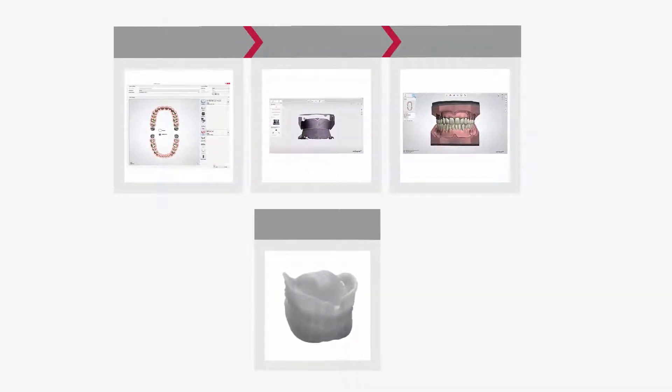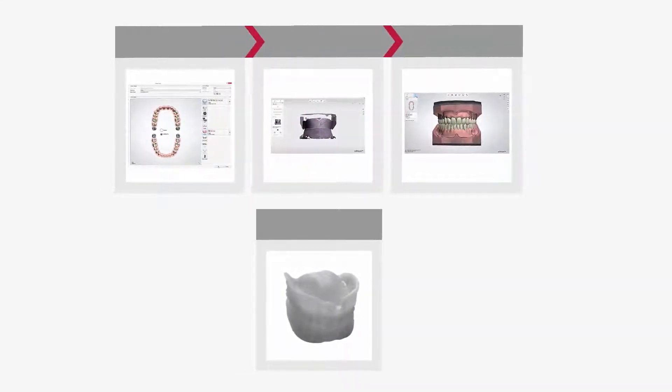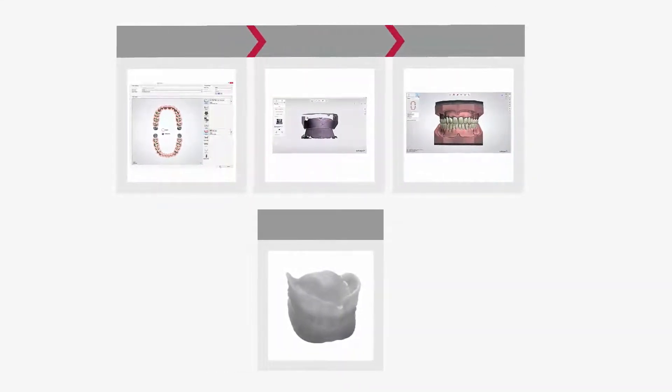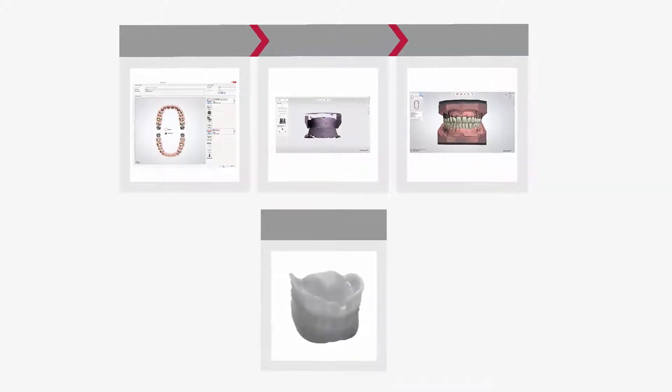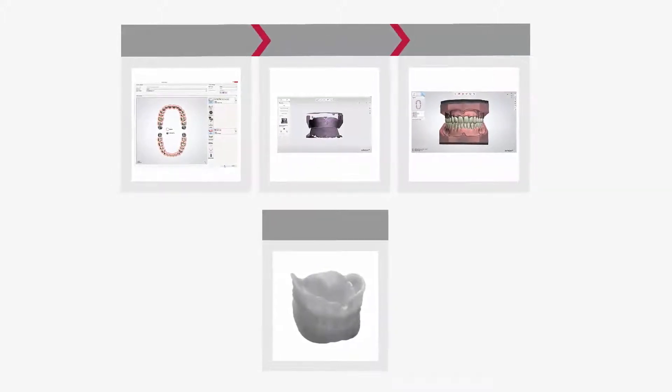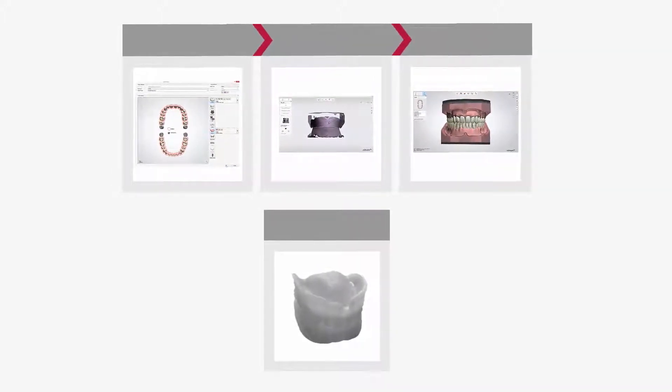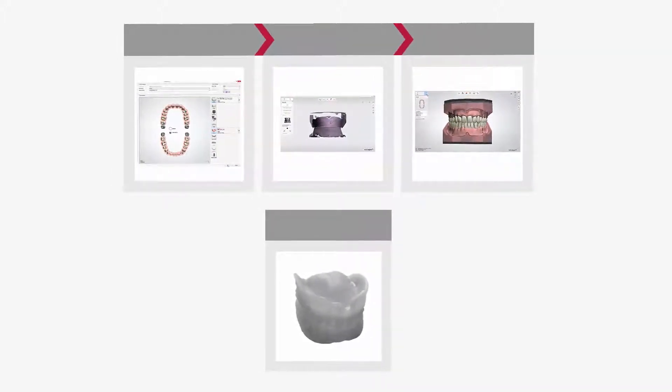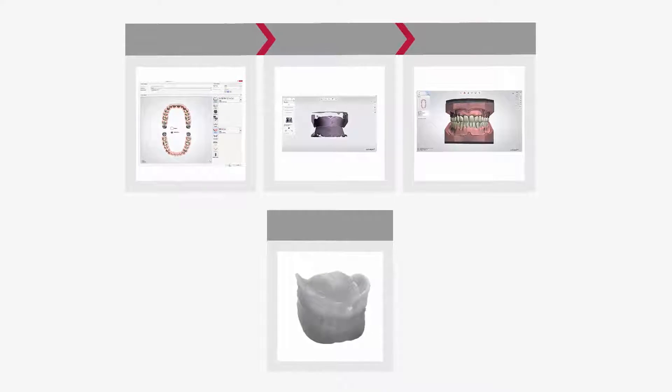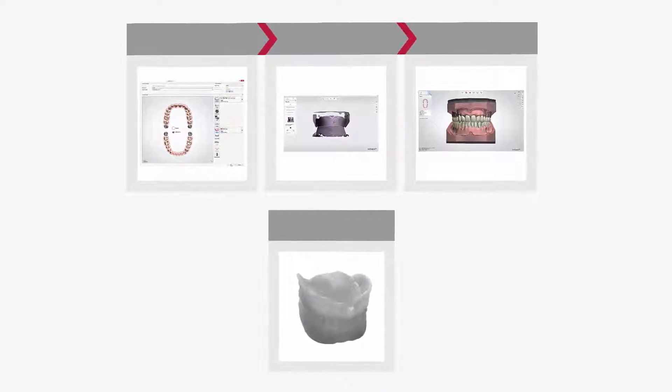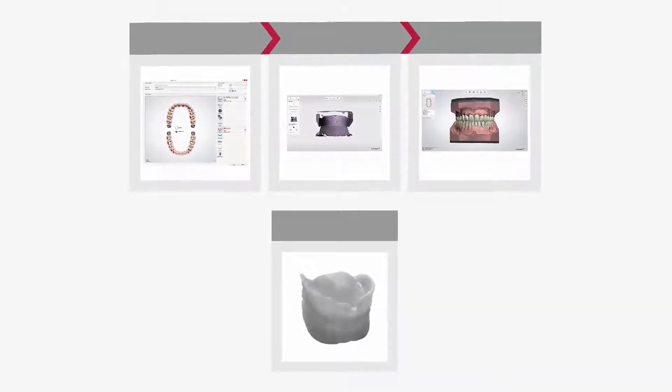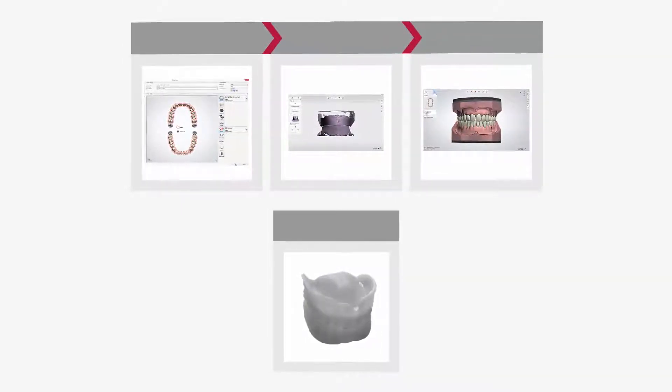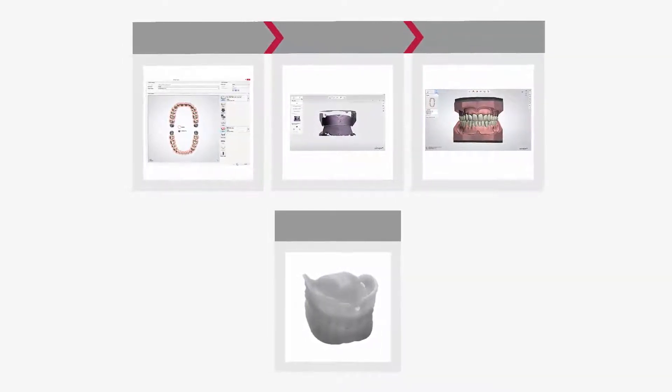Once the try-in denture has been checked and physically adjusted, you can scan it and add the updated shape to the existing order. The try-in model becomes available as a visual guide during all design steps for aligning adjustments with the original denture.